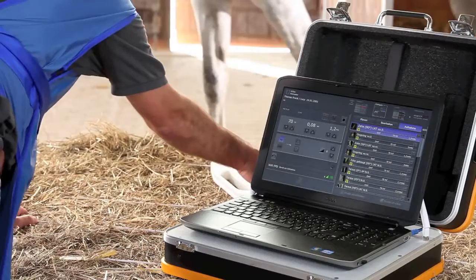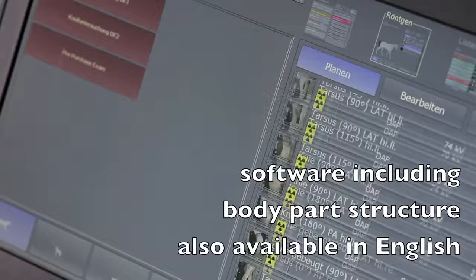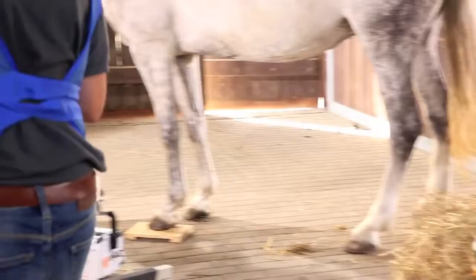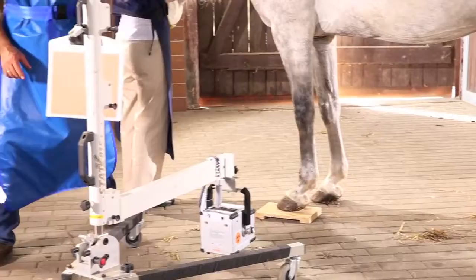The software is optimally adjusted to the needs of veterinarians. It is available in various languages including the organ tree. Specific examination procedures can be adjusted and automated. The entire examination process can be completed without manually operating the laptop, thus saving time.